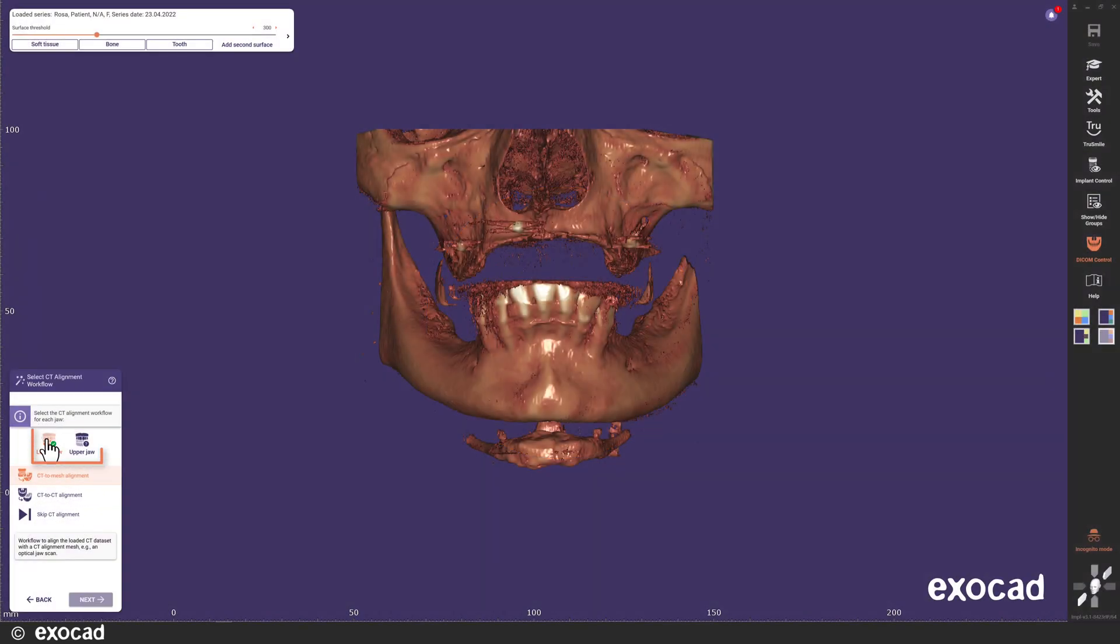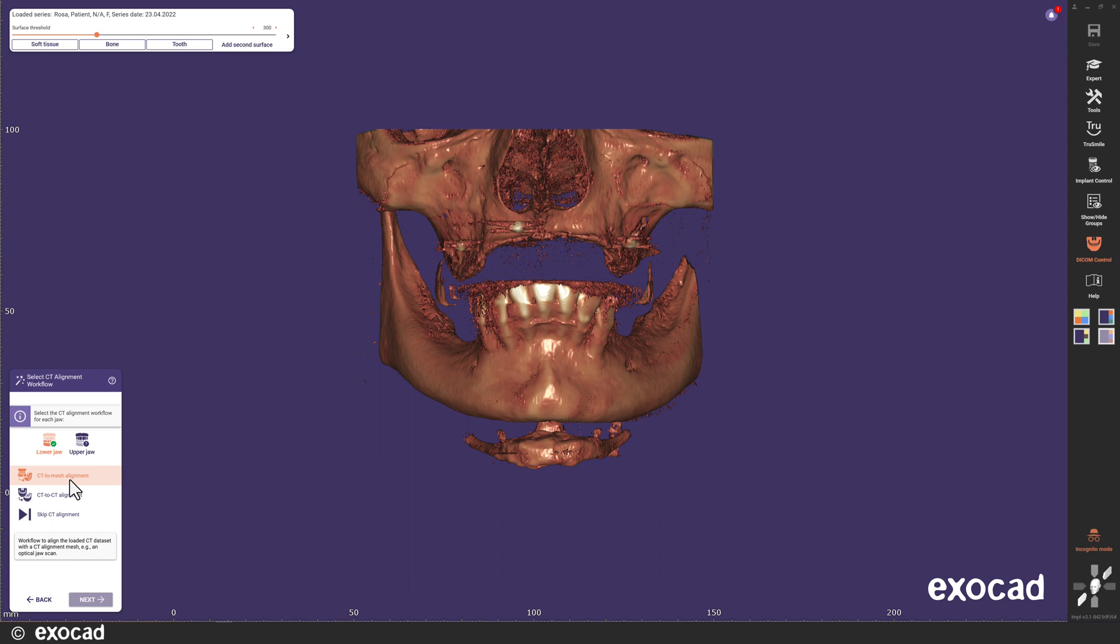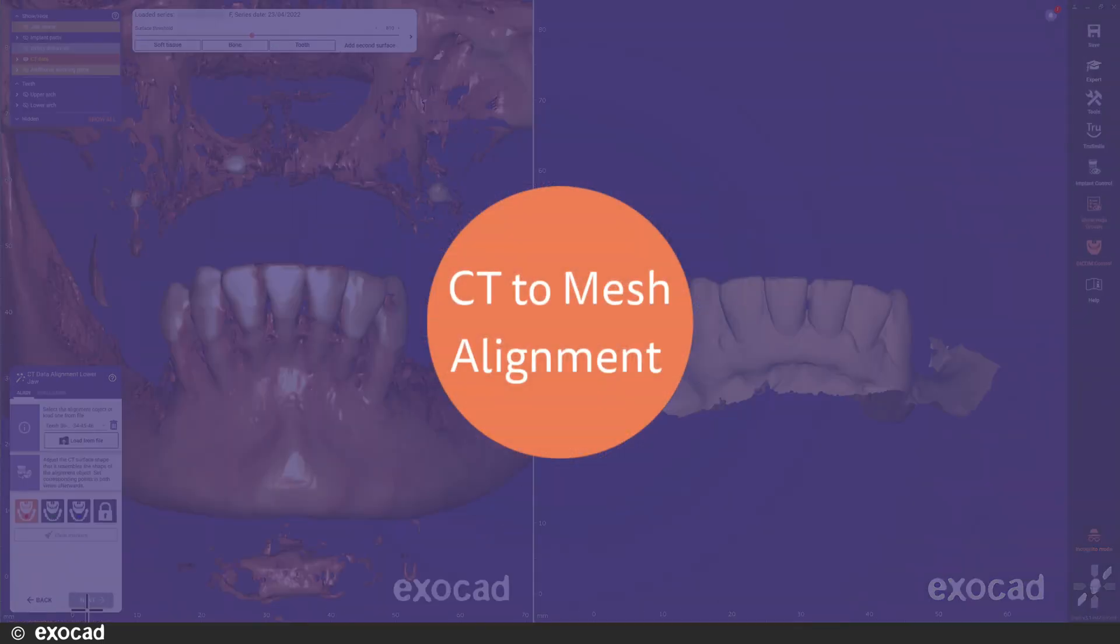Since I am working with both upper and lower jaw, I will define which alignment workflow to use for each jaw before I continue. Aligning the CT data is necessary if you later want to design a surgical guide. If you do not want a surgical guide for the current case, you can skip the alignment and continue the implant planning without aligning the CT data. Since I want to create surgical guides for this case, I select the alignment workflow I want to use. For the lower jaw, I have an intraoral optical scan and I therefore select the CT to mesh alignment for the lower jaw. For the upper jaw, I select the CT to CT alignment since I have a CBCT scan of the upper jaw prosthesis.